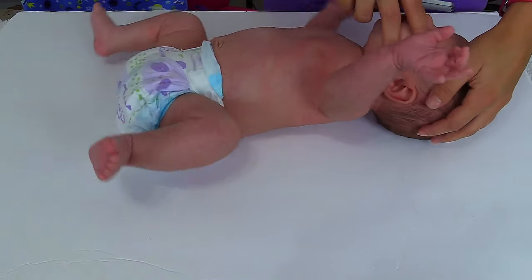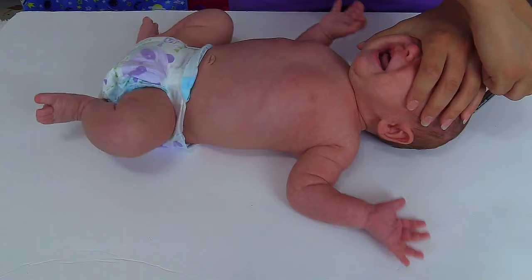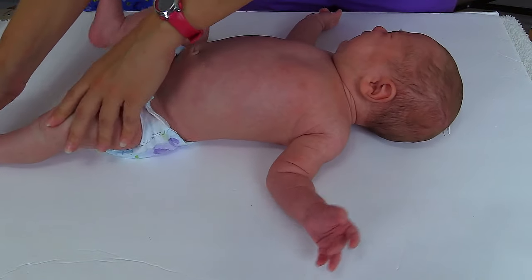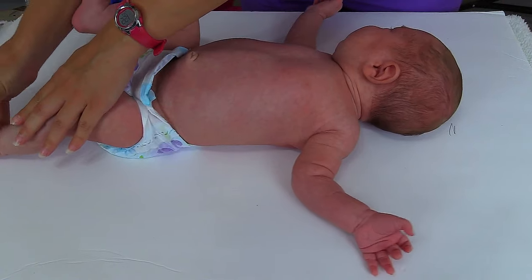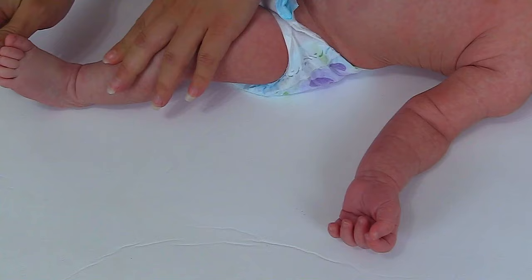Lay the baby back. You'll want to put their head midline like this and then just mark their head. Then you want to take the leg and extend it outward like this. Make sure it's nice and extended — you may have to work with them a little bit — and then mark it at the heel.